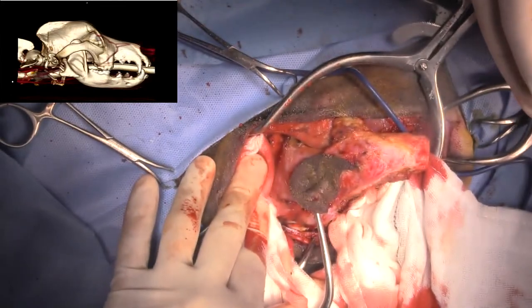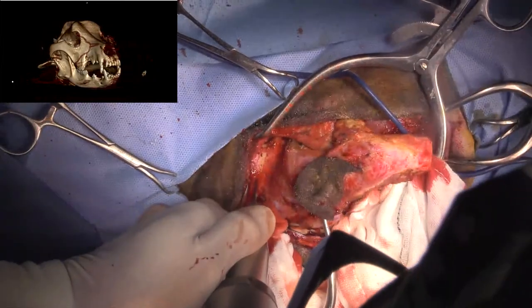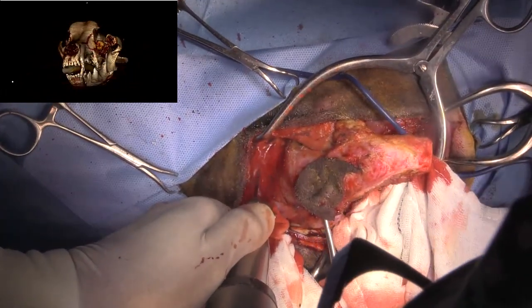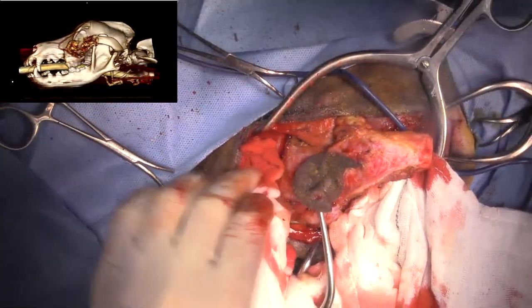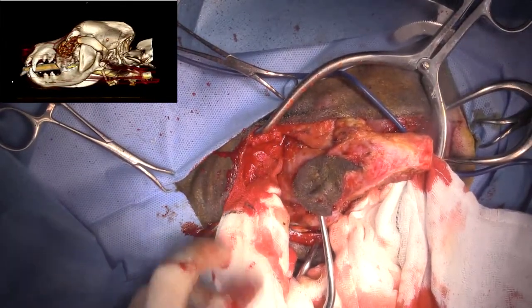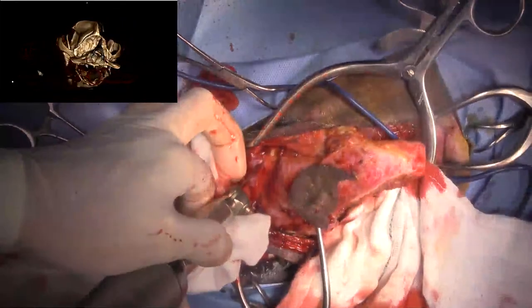Waiting for a yank on our suction tip. We've lost our suction line. Because we're getting into nasal mucosa, we're going to start getting into some more significant bleeding here. And it really won't stop until you get the whole thing out.